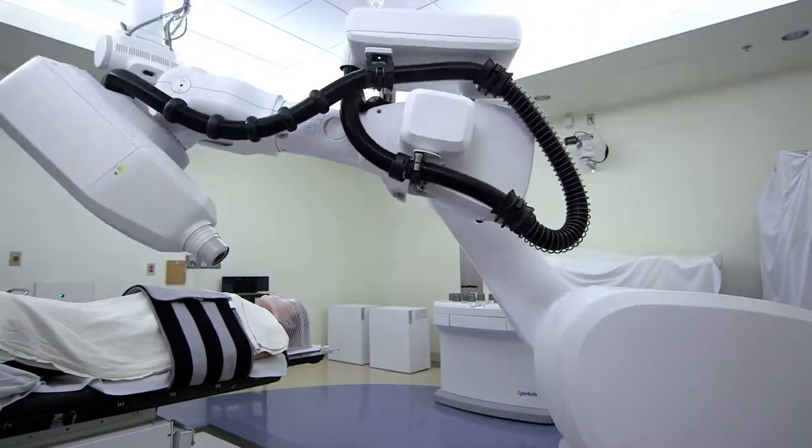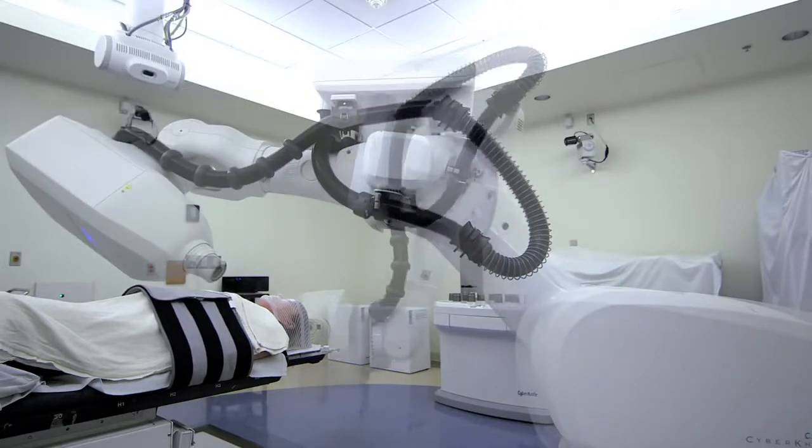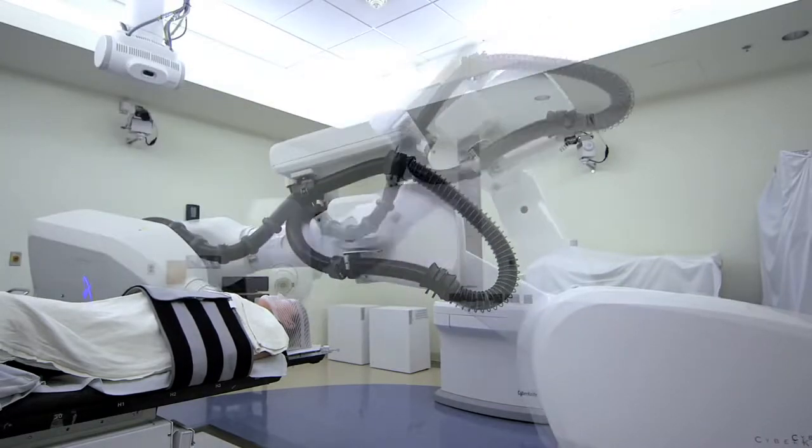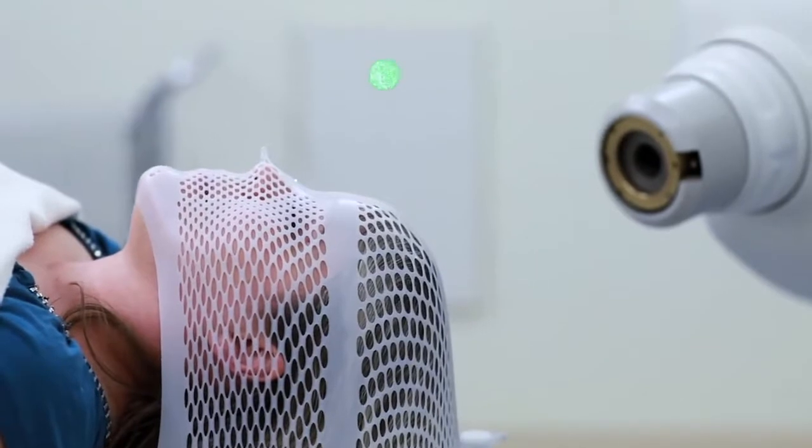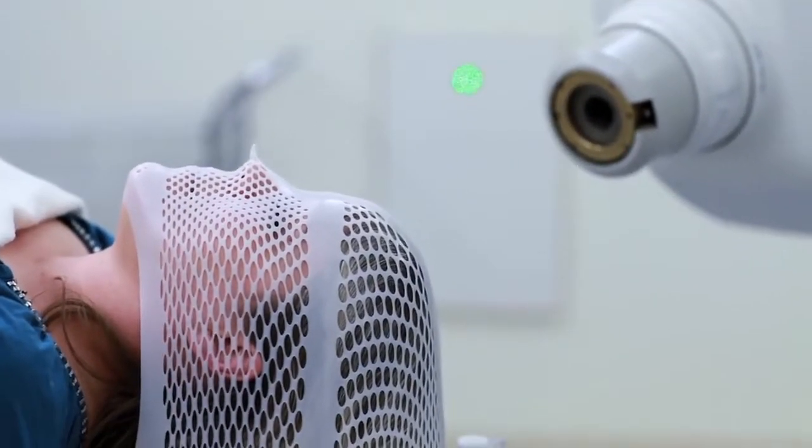The first reaction was, wow, this looks like something from Star Wars. Very quickly it became apparent that this could change the way we treat patients.